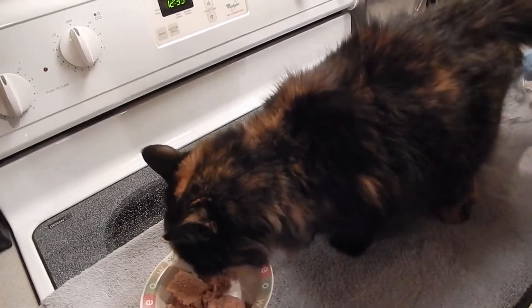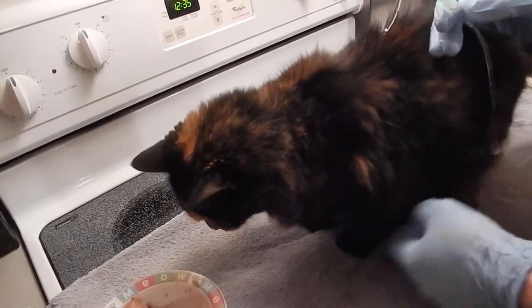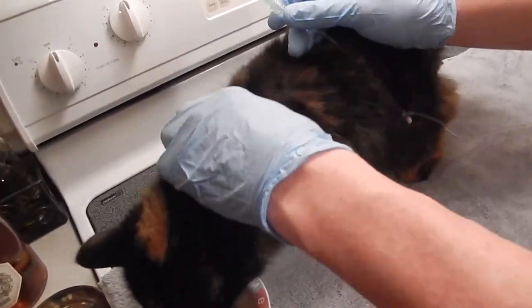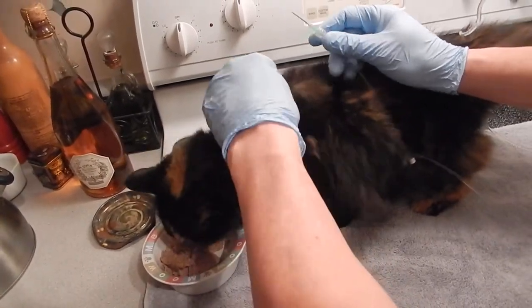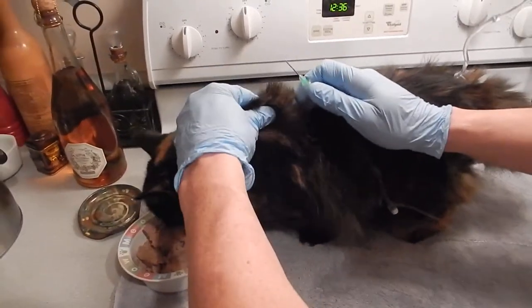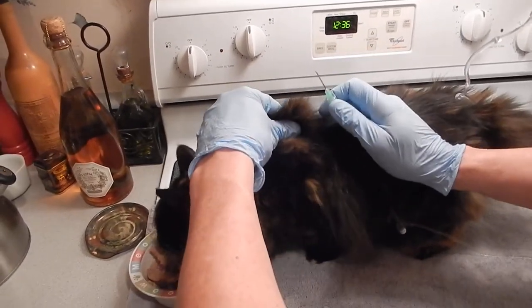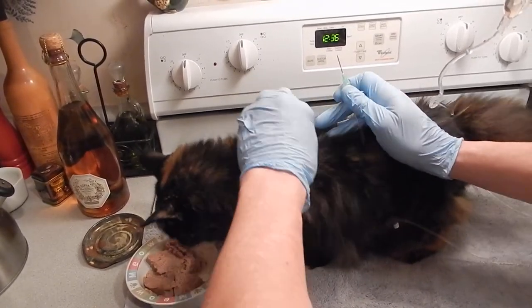Here's the needle. I'm going to get her by the scruff and put the needle in the scruff right here, like where her mom picked her up when she was little. Come on, Fufu — you can eat. Be good for the camera. This is where it's tough because her skin is so thin and I don't want to go through.